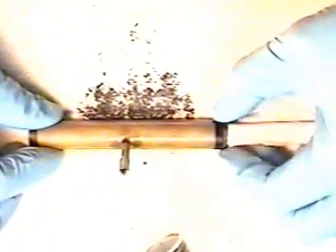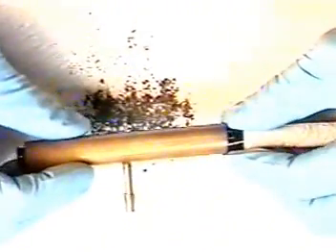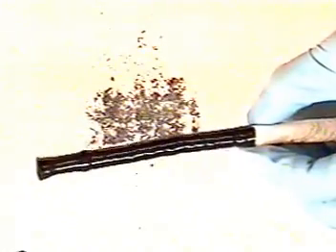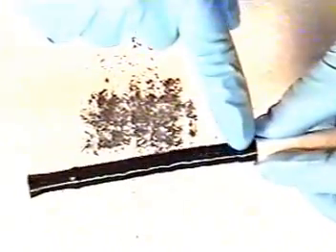Release pressure in the syringe. Pull the bending rubber out of the vacuum tubing. Slide the vacuum tube off of the bending section. The bending rubber has now been applied onto the bending section. Discard the paper towel with molybdenum graphite powder if used.